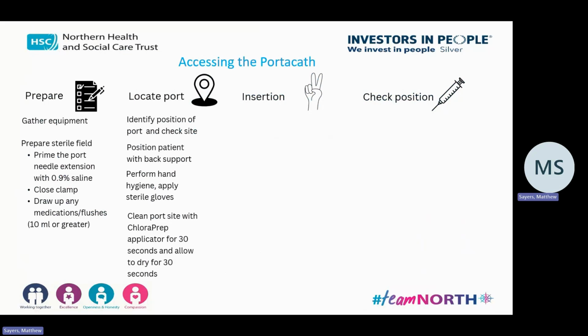So you will all know, you click that and then you clean for, now Lisa's come up with this brilliant analogy. Right, go for it, Lisa. Yeah, that as you're cleaning, you're making the germs drunk. 30 seconds, they're drunk. And the 30 seconds drying is them dying, basically. So the drying is as important as the actual cleaning.